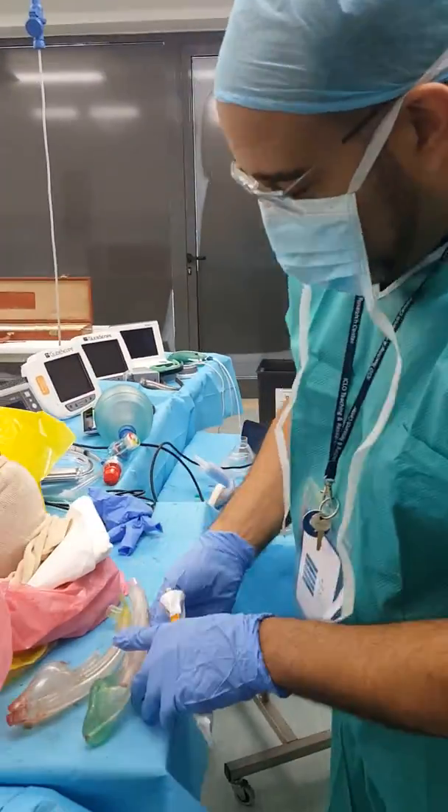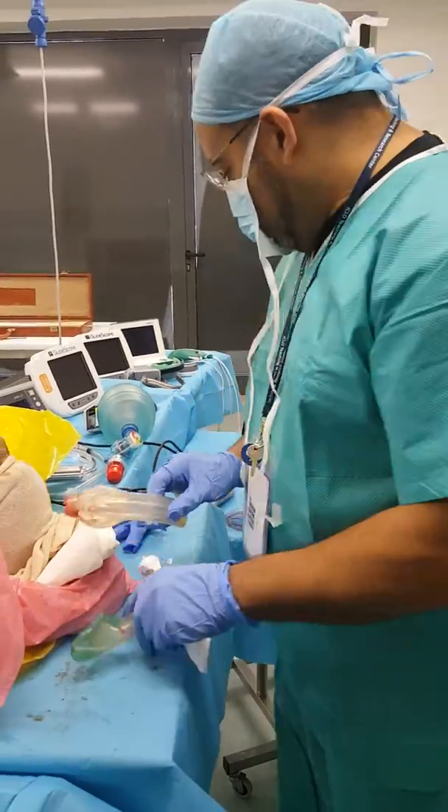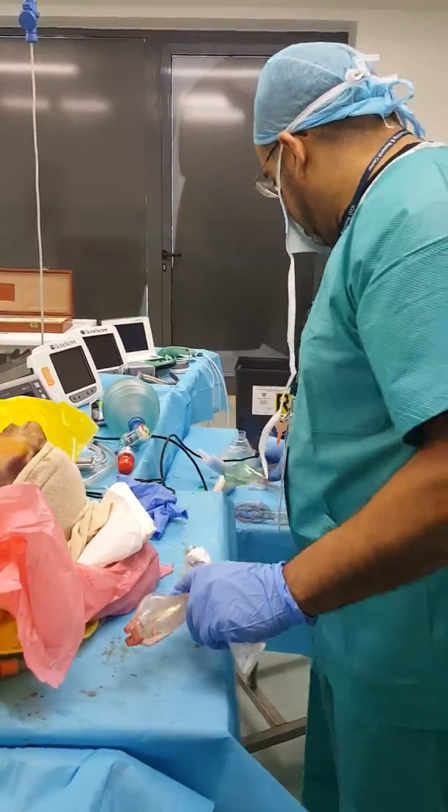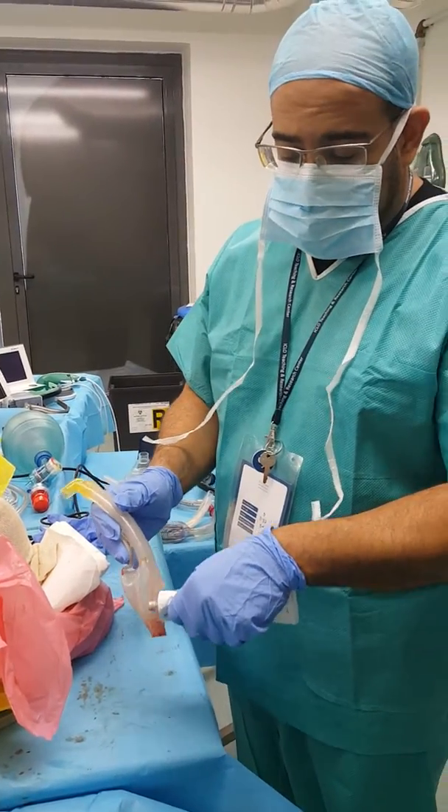Dr. Torres from the cadaver lab in Italy. Now I'm going to insert some supraglottic devices. This is the Baska, which I've never put in a cadaver or a live human before.